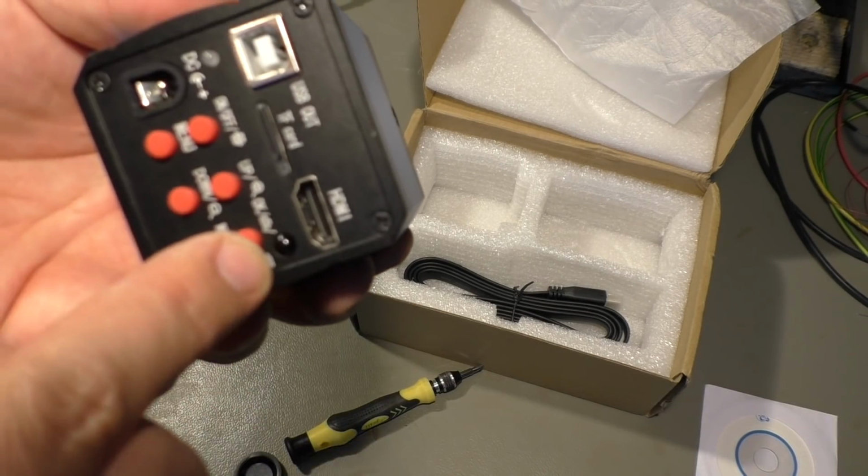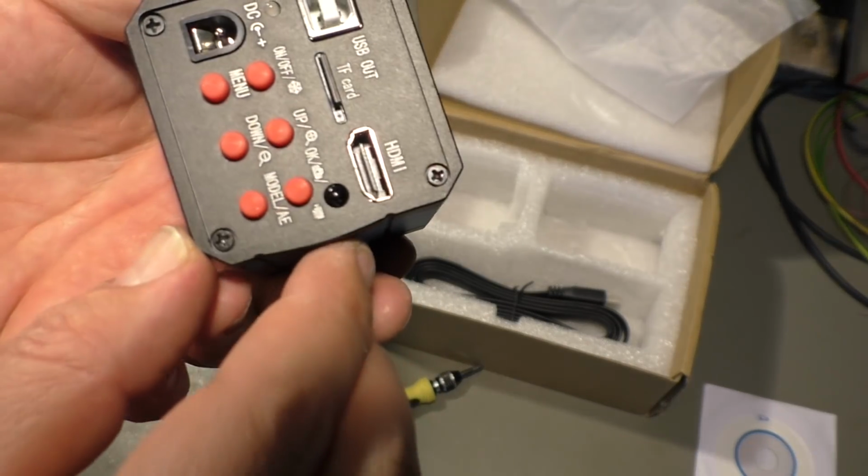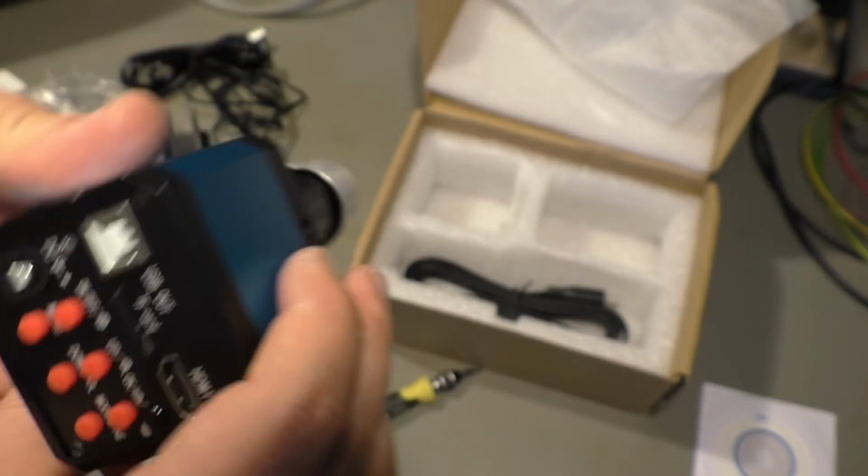Okay, that's the remote sensor. That's something I wondered what that could be. LED, okay.